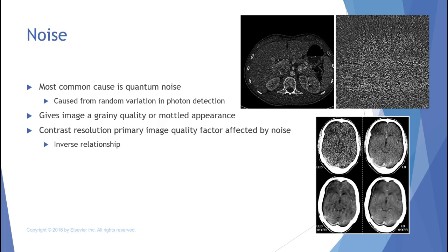They've obviously not used enough dose. But sometimes when you have patients that are very fluffy and you put them in the protocol scanner, if you forget to modify the protocol and increase your dose manually, you can get these grainy appearances. And it's very unlikely that you're going to be able to get diagnostic imaging out of them, so you're going to have to get the radiologist on board to rescan. So that's something CT techs really need to be cognizant of, looking at the parameters of their protocol before they hit that scan button. Okay.